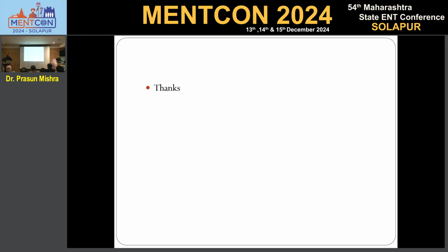Anyone? Yes. Any questions from anyone? Anything I missed out? I should have said more. No, what problem with the flexible, your maneuverability and your easiness is much better. Agreed. Yes.